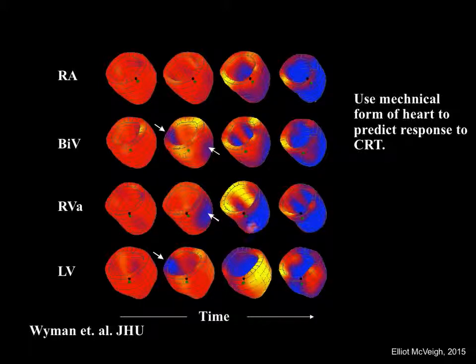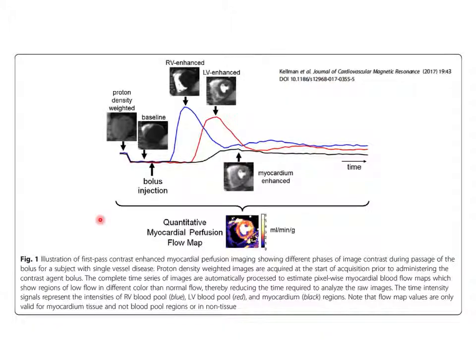And you can see the contraction move out from the pacing site. So where you pace the heart, it contracts early there. And in fact, because it's contracting, the other side hasn't been electrically activated and it gets distended. So you get this asynchronous contraction. And you can measure it very accurately with MR tagging. Okay, any questions on mechanical issues? And you can imagine that if you did a stress test and you look at mechanics, and the mechanics starts failing in a person under stress, that is a tremendous indicator of significant ischemic disease, that which causes a symptom or a sign.